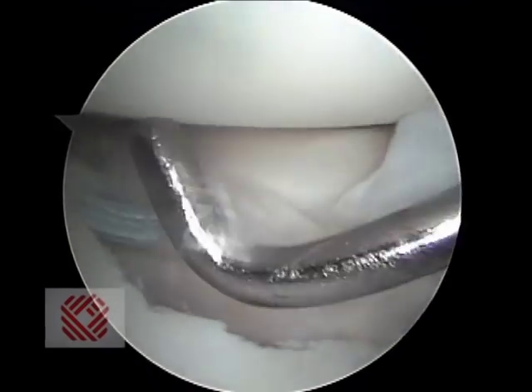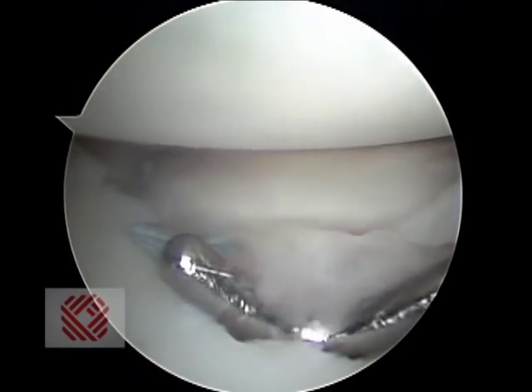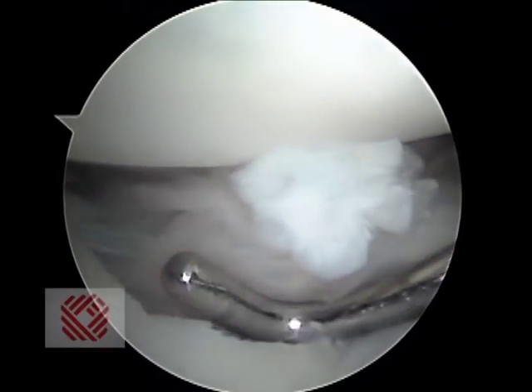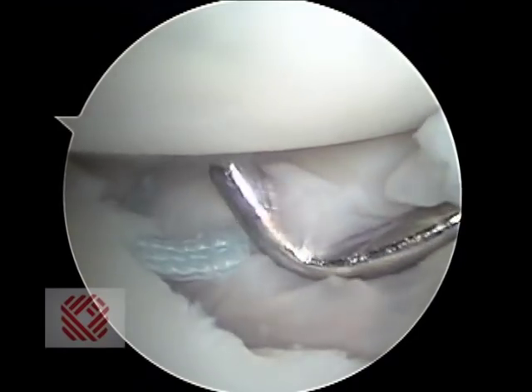With that, there are no sutured knots — nothing. Knotless anchors, knotless repairs. These are much less likely to cause arthritis in the shoulder. Now we're going to put our second implant in.